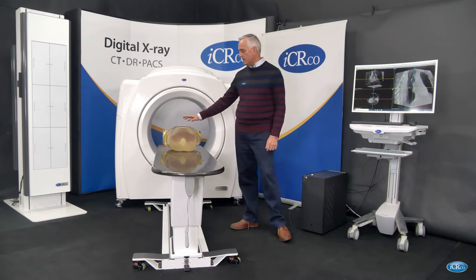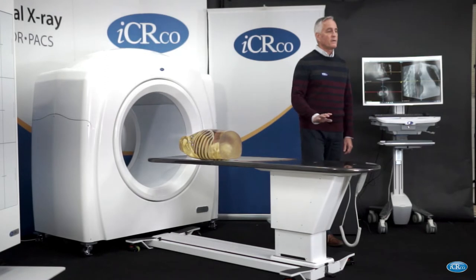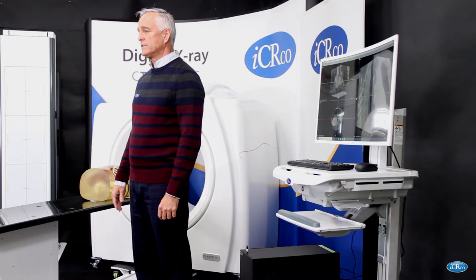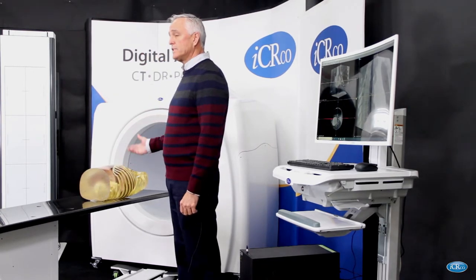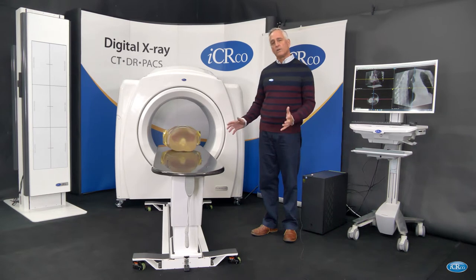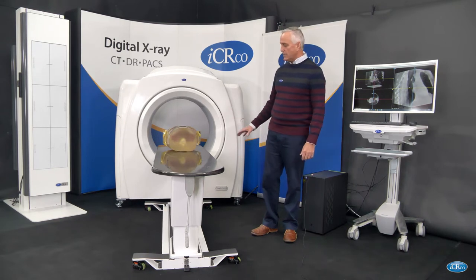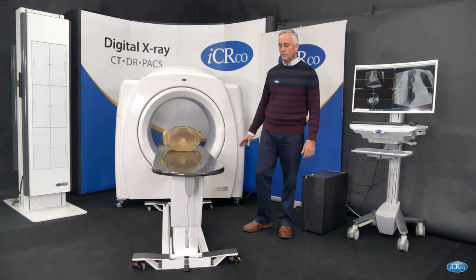Today we have a patient that needs a chest scan, and considering the time that we're in with coronavirus activity out there, this machine may be used for early detection of coronavirus infection. We haven't tested that yet — this is a very new machine — but this is the direction we're going. So in theory we can take this image and examine it for COVID-19.